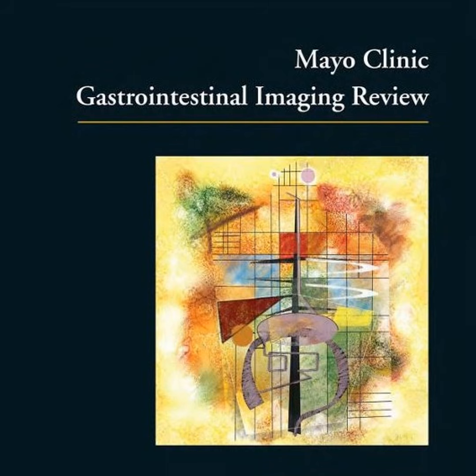Oh yeah, the landscape changes entirely. Here, we aren't just looking for isolated structures. We are mapping out complex, dynamic, regional inflammation. Crohn's disease, for example, provides one of the most challenging imaging landscapes in all of GI radiology. Because, and the text points this out as a crucial clinical trap, the radiologic findings correlate very poorly with the patient's immediate clinical activity. They really do.